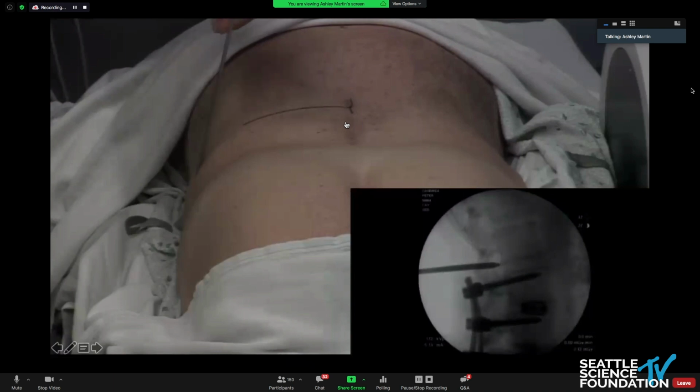Okay, so it's pretty good. Typically, okay. So this is a case I did about 3 weeks ago, recorded for this since we couldn't do a demonstration in person. Right now, we're targeting the disc space here at L2, L3.